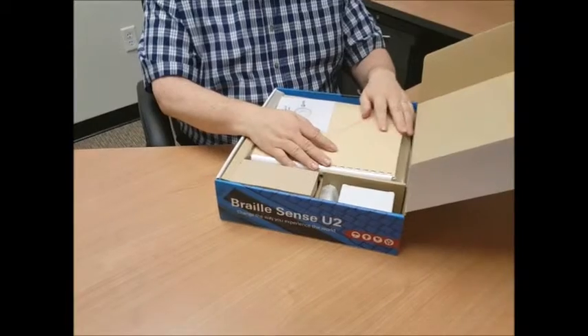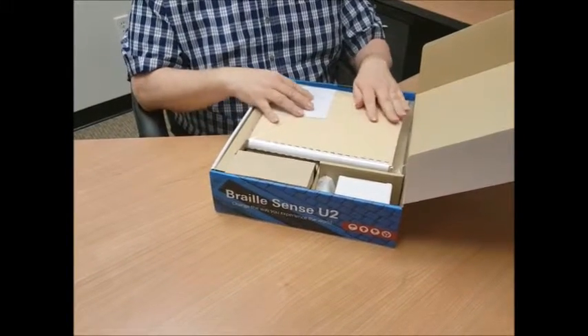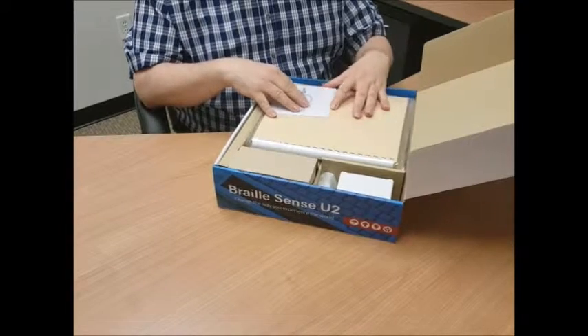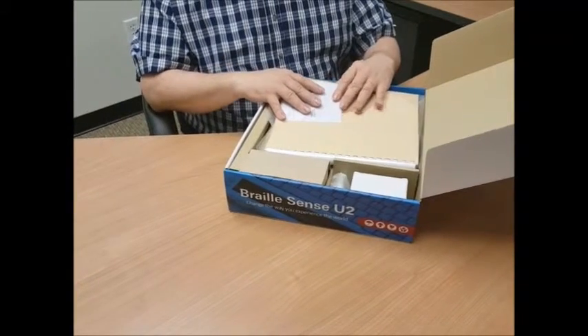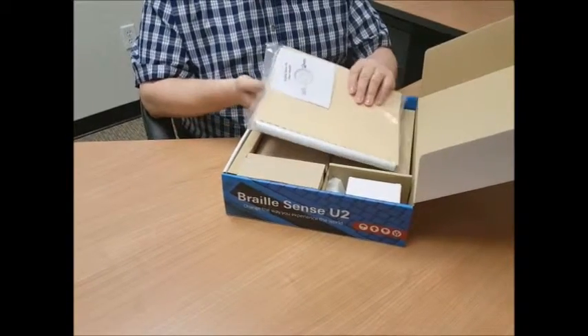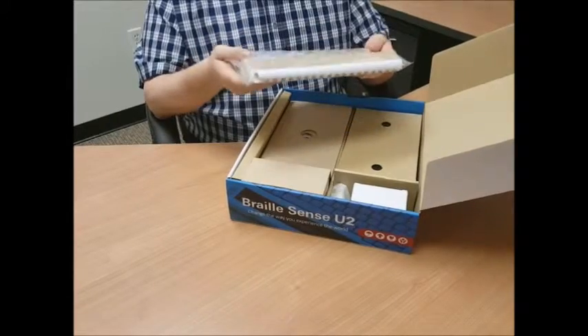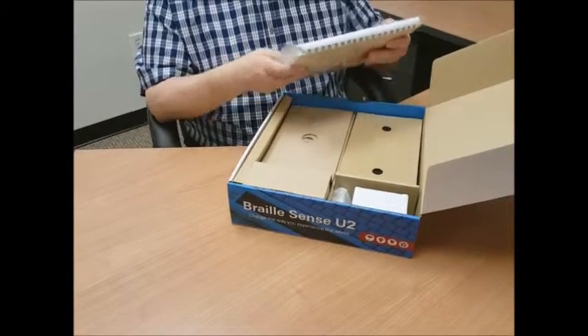The first thing you would probably feel is a plastic bag that has kind of a book in it. That's the Braille command summary. There's also a CD in there and a print command summary, all in this nice ziplock bag together for you. So I'm going to set that aside.